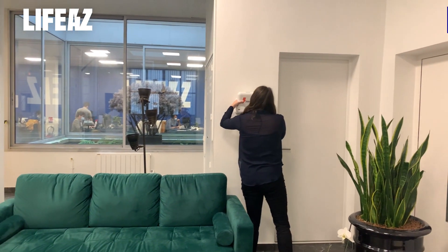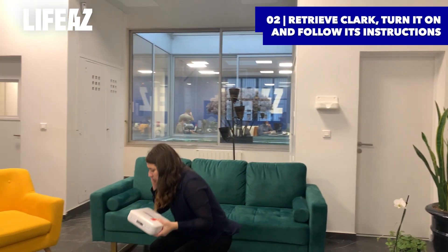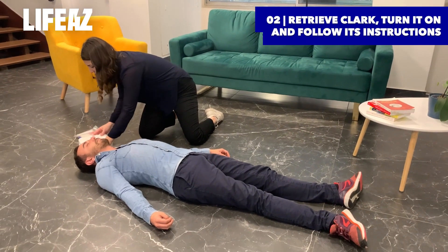At the same time, retrieve your Clark defibrillator if it's within immediate proximity. Place your phone on speaker next to you so emergency services can guide you until they arrive.